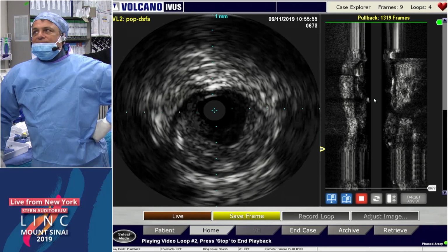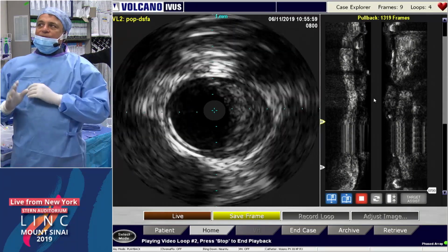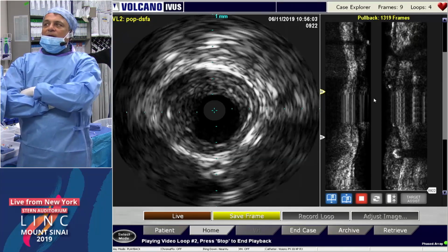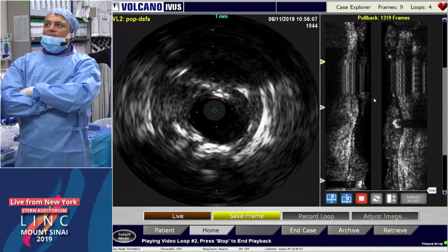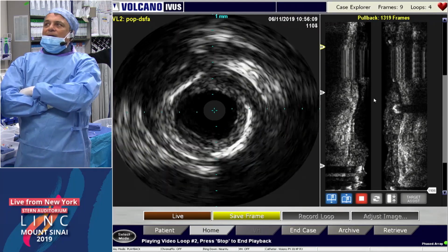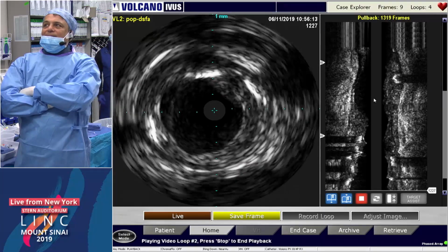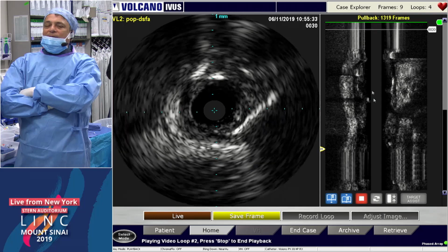A lot of plaque in this area. And I think ultrasound can help us make a decision on what type of therapy we're going to do. Already by looking at this, in our minds we're going to do some sort of atherectomy in the distal segment of the pop because there's a lot of fibrocalcific plaque. And then as you come into the SFA, you can see that your plaque is a lot less. And really the areas that are stenosed are the areas that will be compressed.